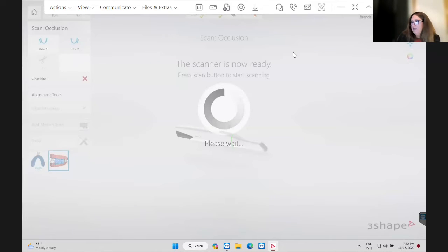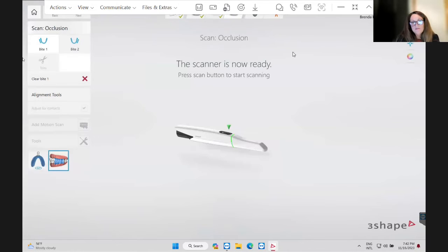And if you see on your Trios, there is where it shows a bite if you're putting your dentures together, but you're going to put these back in the patient's mouth. And it's very important too, when you're doing your wash, it's almost like a reline. If they have a lower denture, after you have done all your muscle movements, you have the patient close lightly together. That way, when you try to put the upper and lower in, at least they can occlude, right?